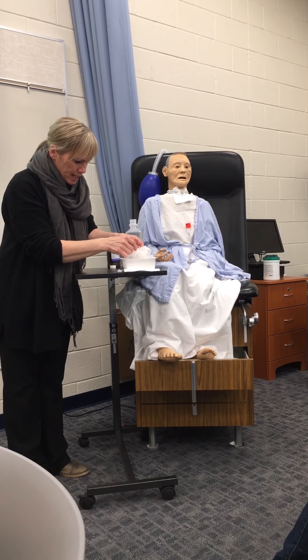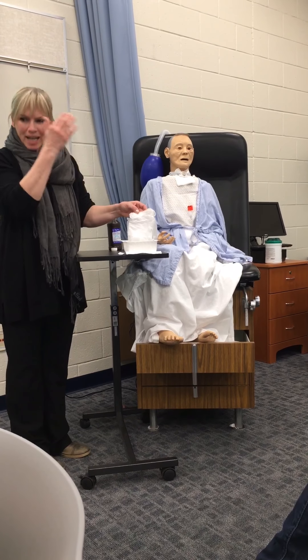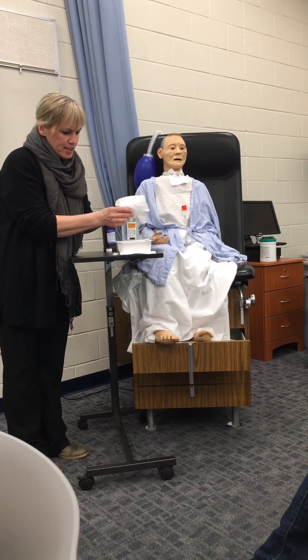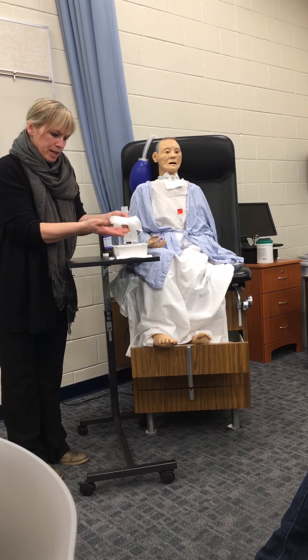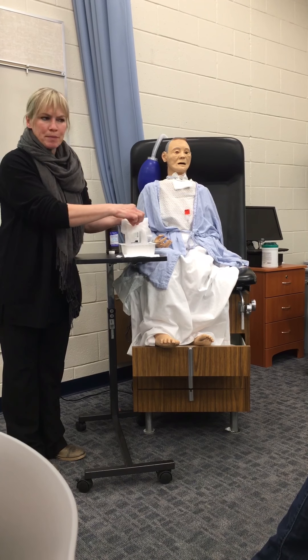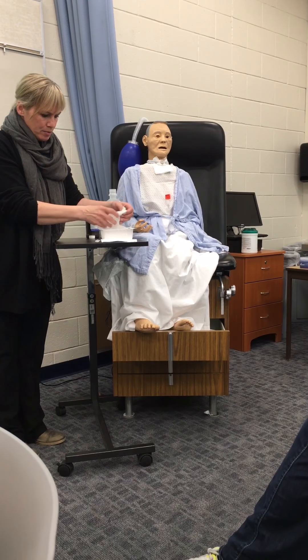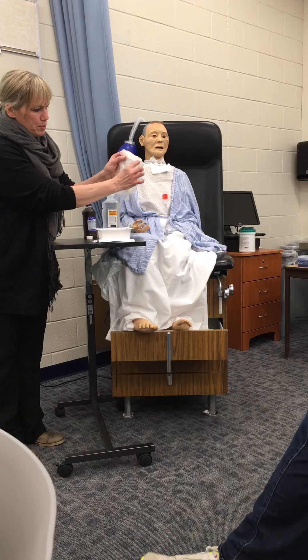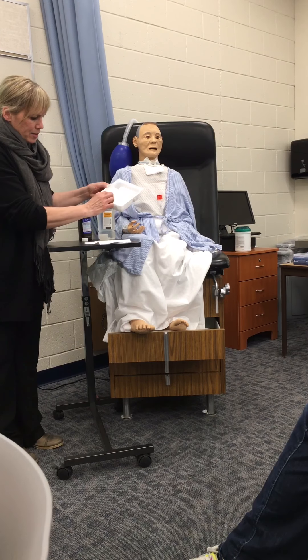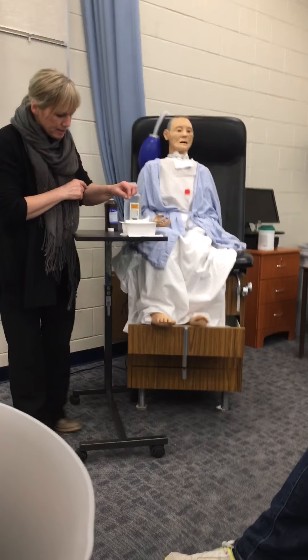So, if I'm pulling here — most times the kits are like this. If that's the case, I have to get new gloves, right? Sometimes the glove was here. Most times it will be cuffed, but the cuff will be really narrow, so just be looking for that. Most times it'll look like that. You can kind of see that ridge, but having that extra pair is key.